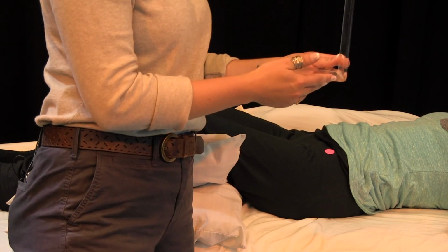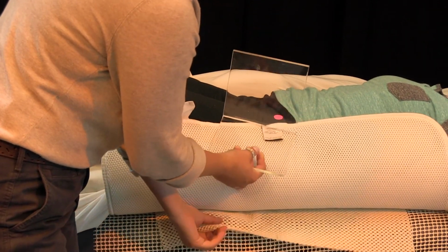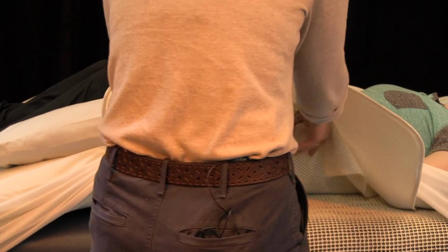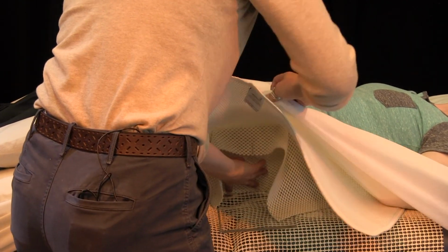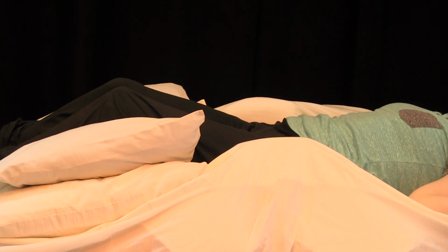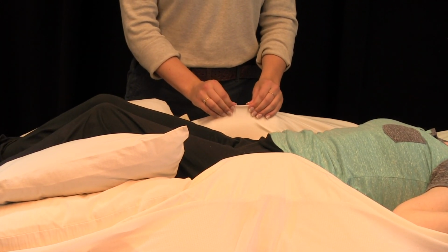And with these type of brackets, use the bottom part facing away from the body, not going under the body. So again, between the non-slip mesh. Once the supports are in place, we will look at the alignment of the pelvis, and if it needs to be adjusted to either side, we can tug on the sheets gently.